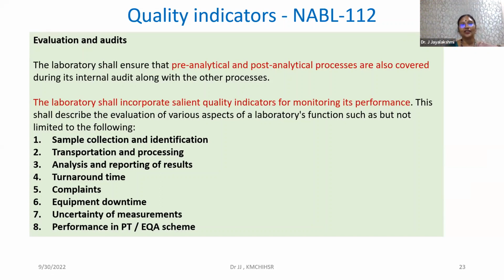So these are the things that are given as what you could capture as quality indicators in each of these areas. But this does not limit you. If you have a unique scenario or setting in your laboratory, you can add more than what is there. These are very few, limited ones.